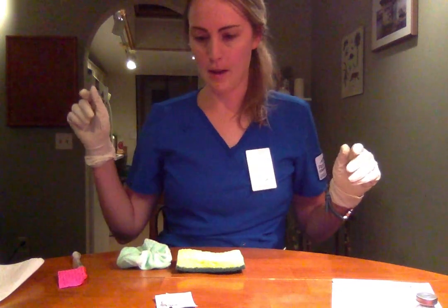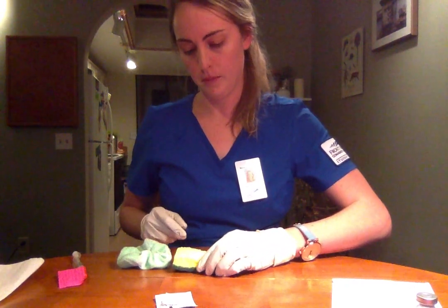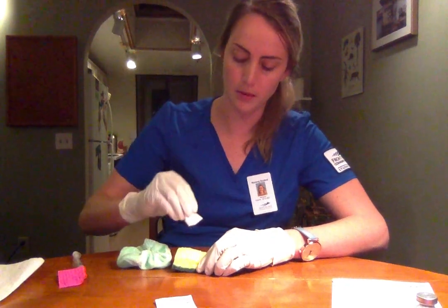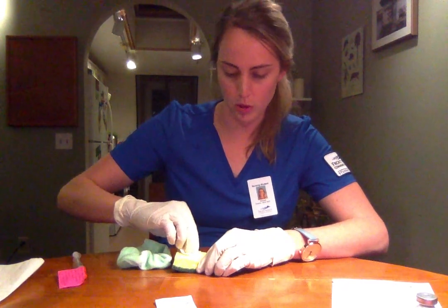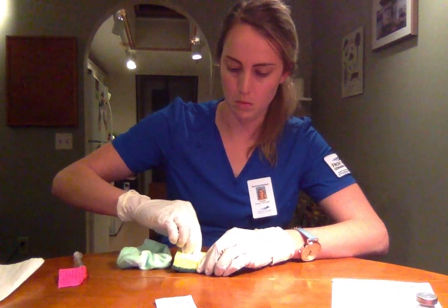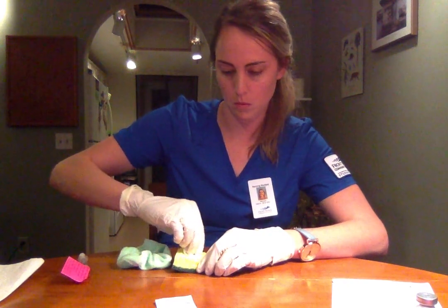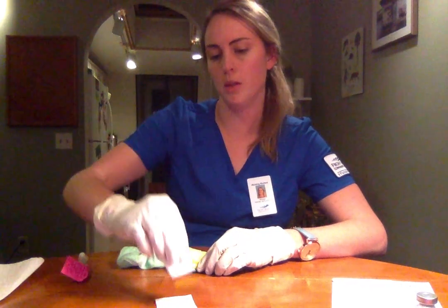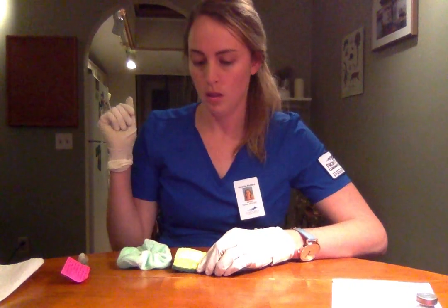So now I'm going to bunch the abdomen and clean the site of injection, or clean around where I'm going to inject. Starting inwards, working my way outwards in a circular motion. Okay, holding the bunch, going to let this dry. Alrighty.